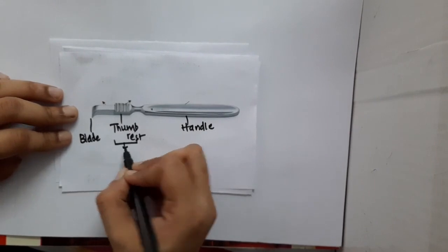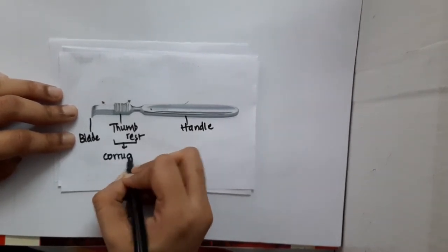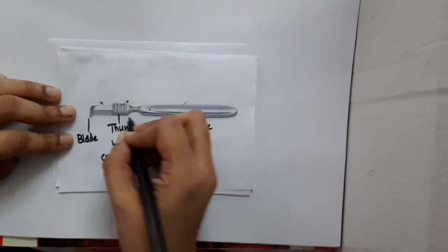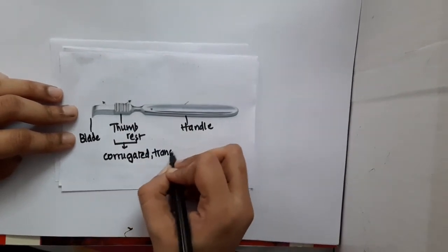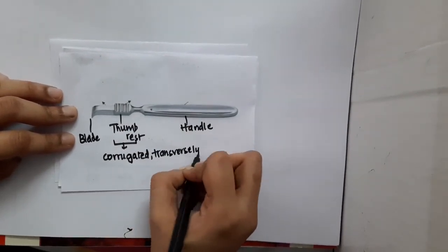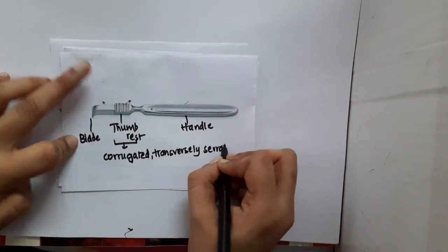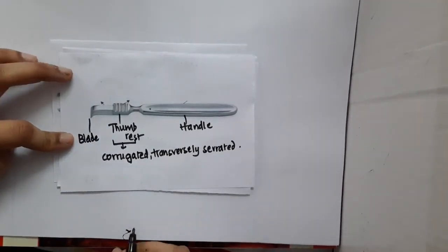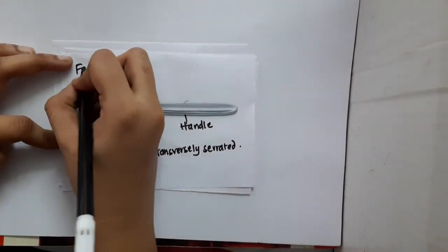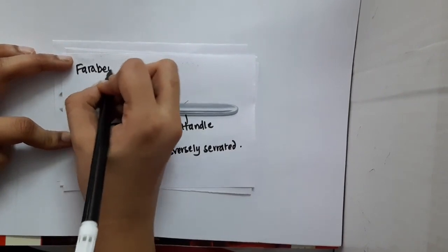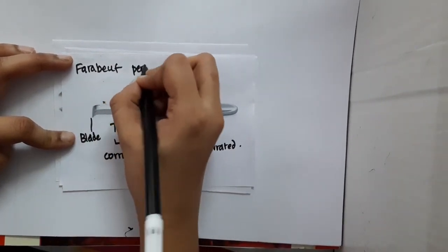If you see the thumb rest, you will see that it is corrugated and it is transversely serrated. The serrations are present - you can see the serrations clearly, right? So what is this? This is Farabeuf periosteal elevator.